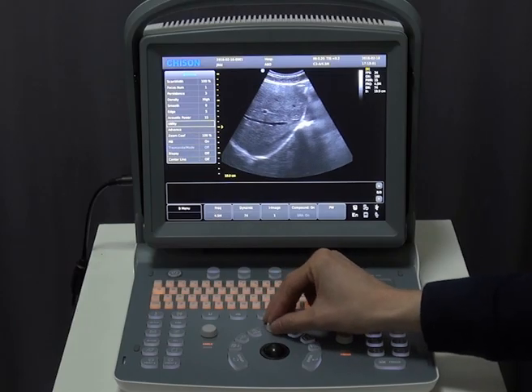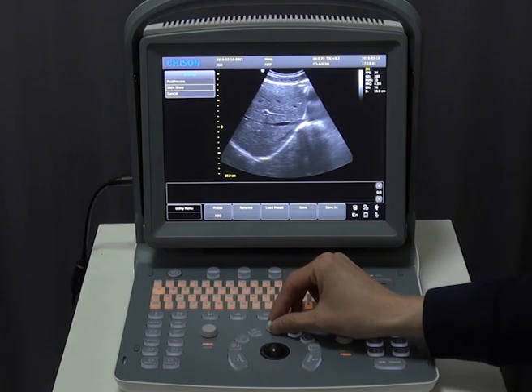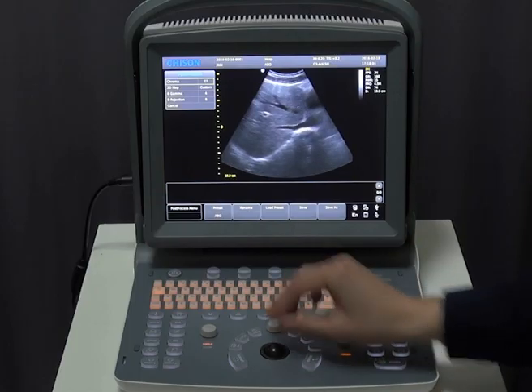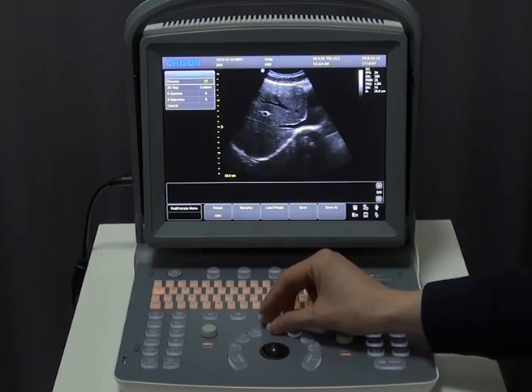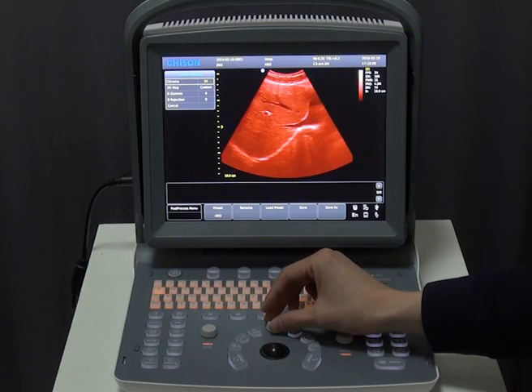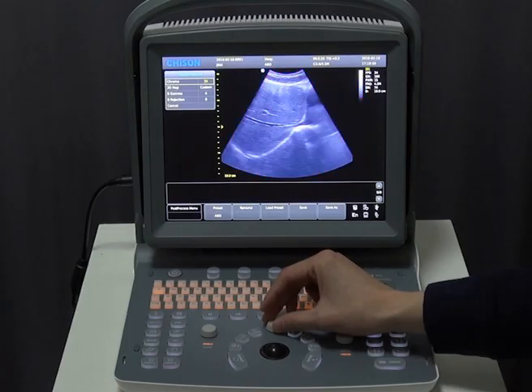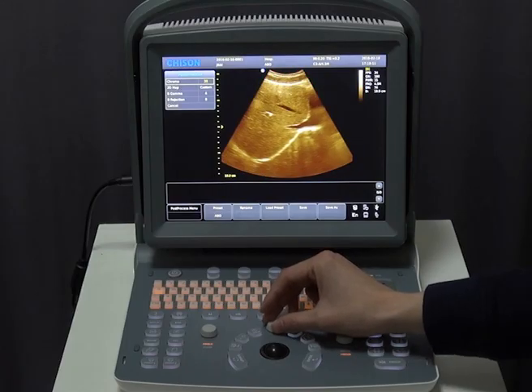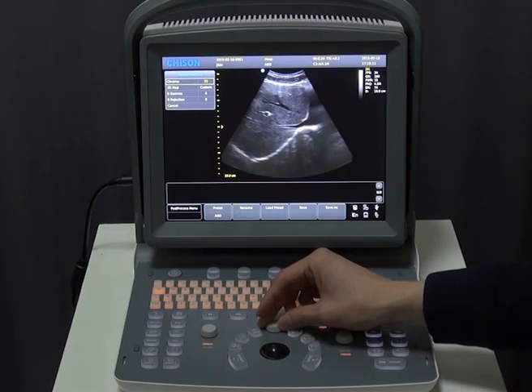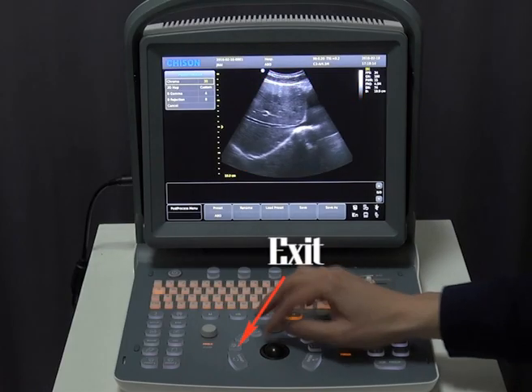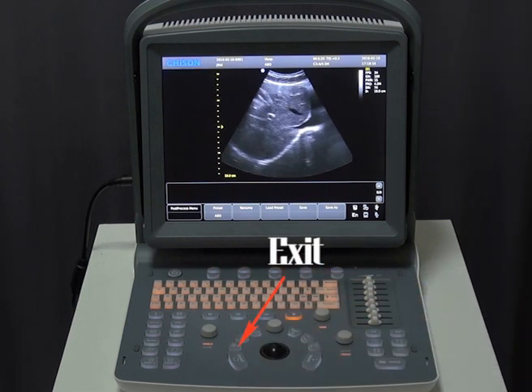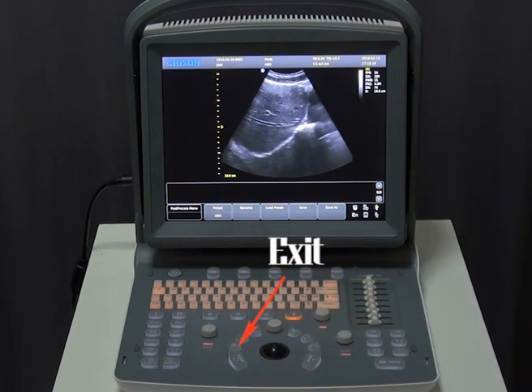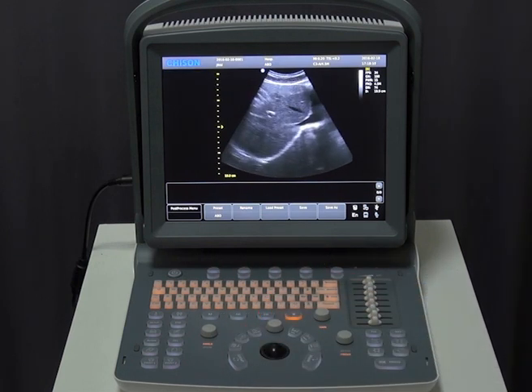For B mode chroma, click Utility, then click Post Processing. We have 40 kinds of chromas available. When we are done, push the exit button and we will go back to where we began.